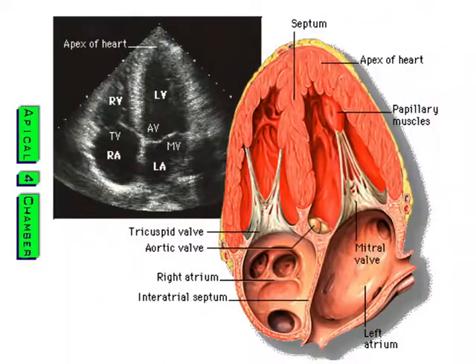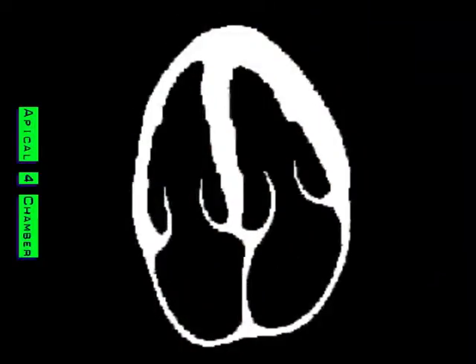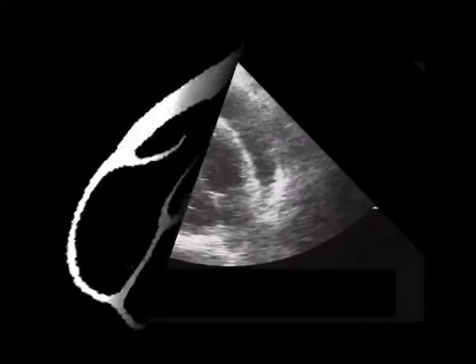You can see the atria, the valves. Sometimes it's hard to get this window, but this is what you're looking at. The indicator is to the patient's right. We've got the septum of the heart right here. LV, the RV looking nicely 2/3 the size of that LV with the atria below it. This is a schematic view of what's going on in the LV and the RV and the atria with its valves seen there in that apical four chamber.